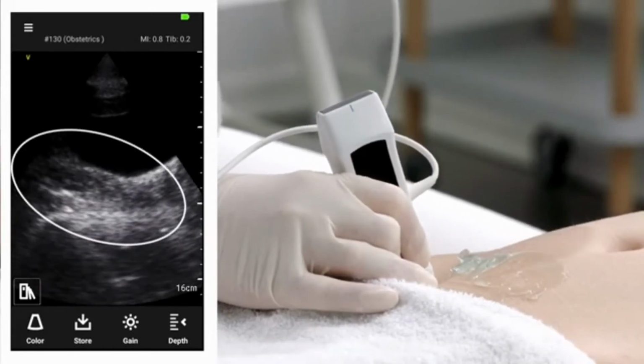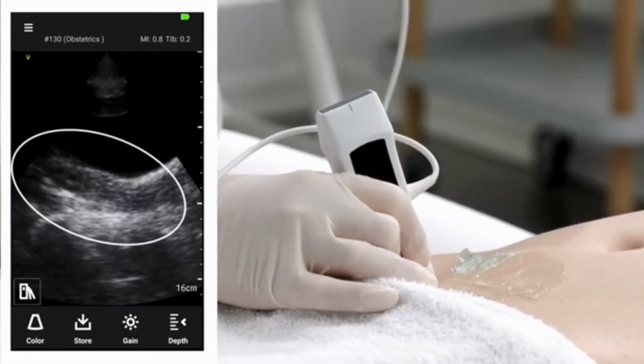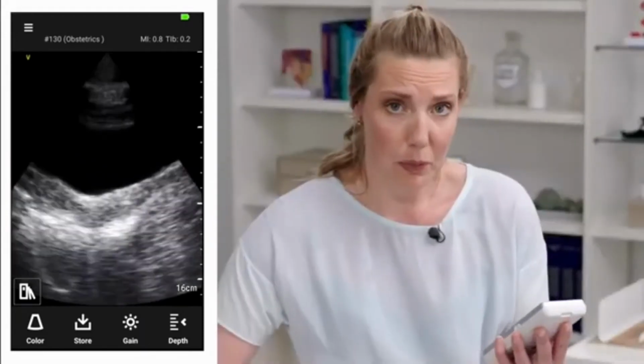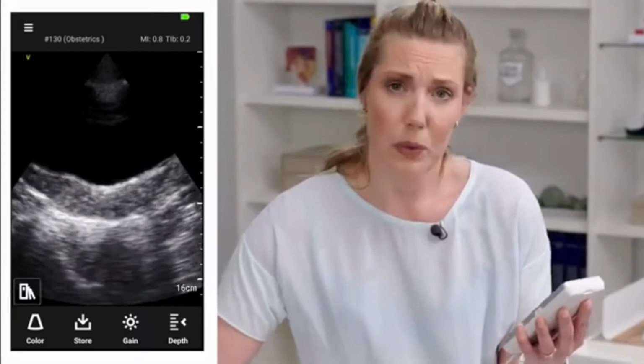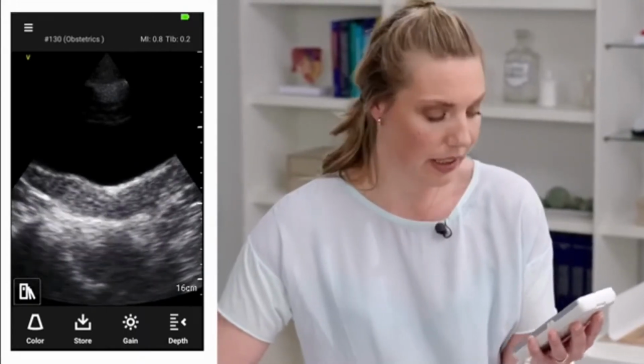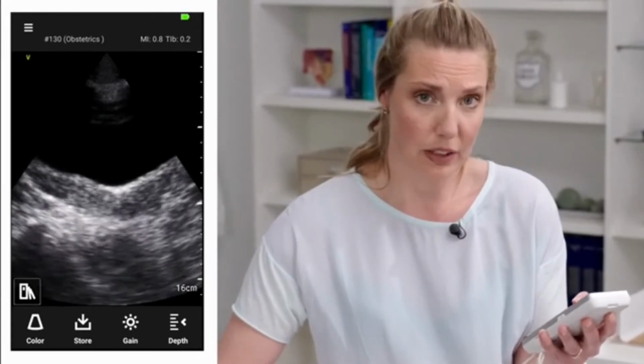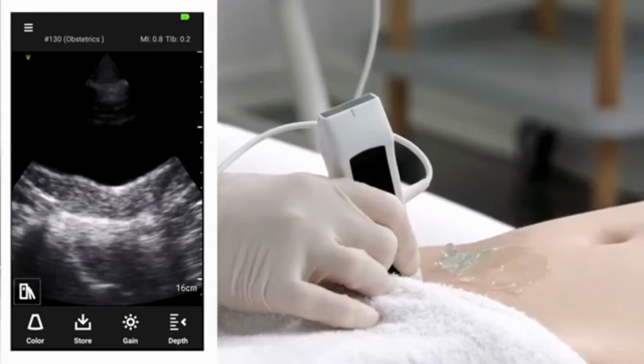We know that because we see the endometrium as a straight line in the middle. If there would be a pregnancy, we would see a pregnancy ring in the uterus. That means that the line of the endometrium, which is now straight, would show us a little black hole.